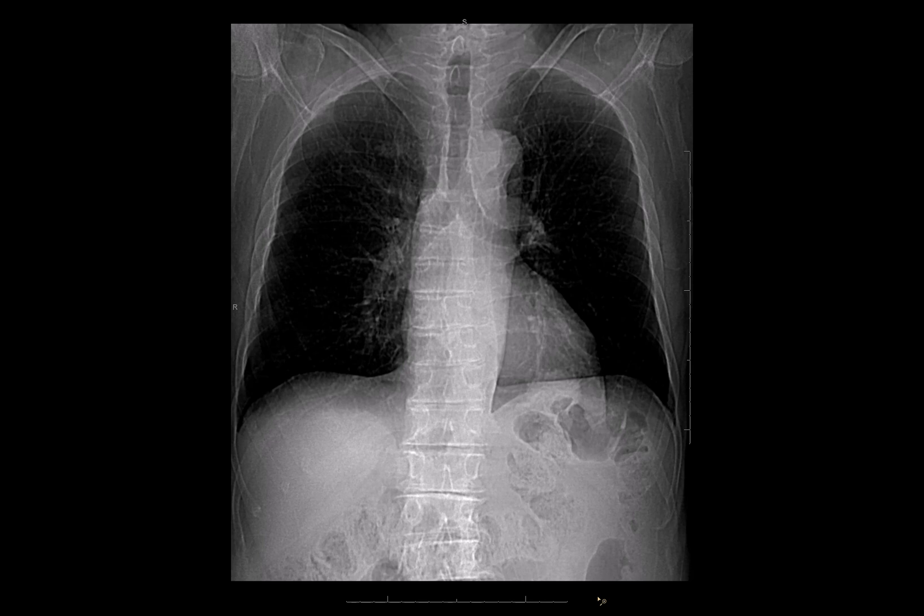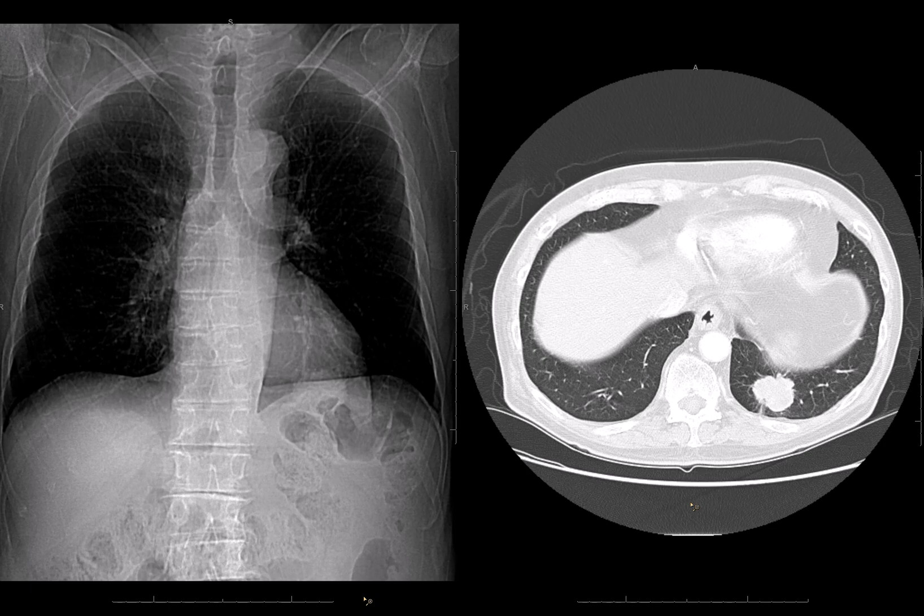Now let's take a look at the axial images. You can see that there's a mass in the left lower lobe with spiculated and irregular borders. It's behind the left hemidiaphragm, and this was biopsied and shown to be a poorly differentiated primary lung adenocarcinoma. Also note its position relative to the spine. On these axial images, we can more fully understand why it causes an abnormality that is superimposed over the spine on the lateral radiograph.